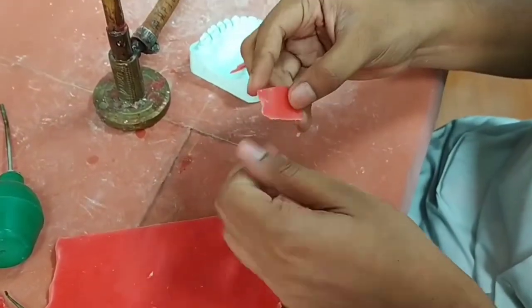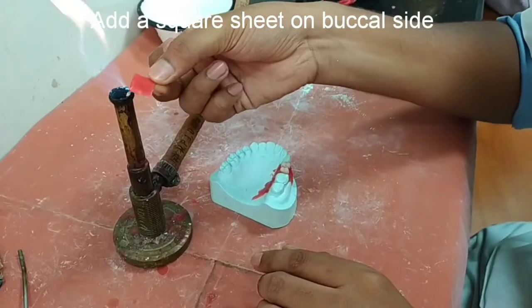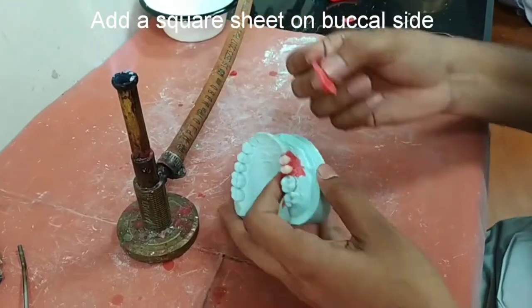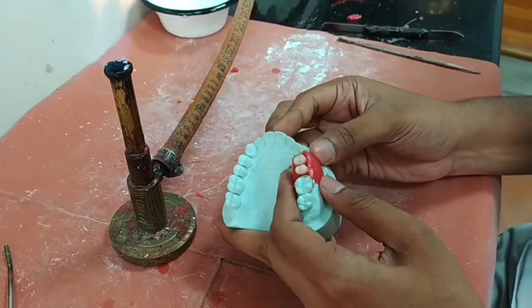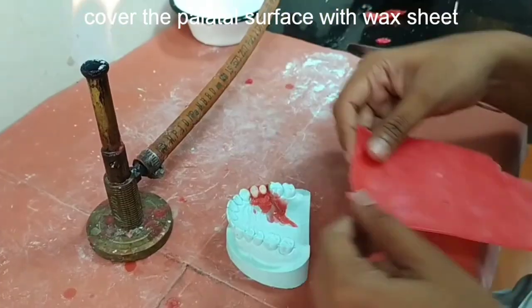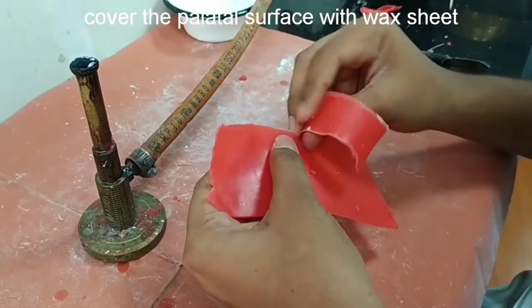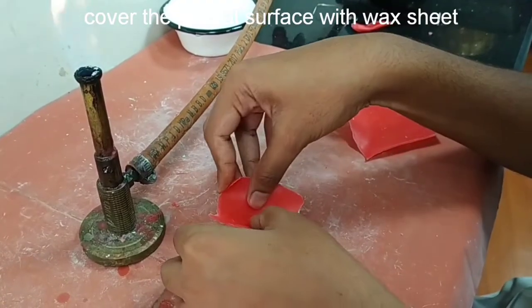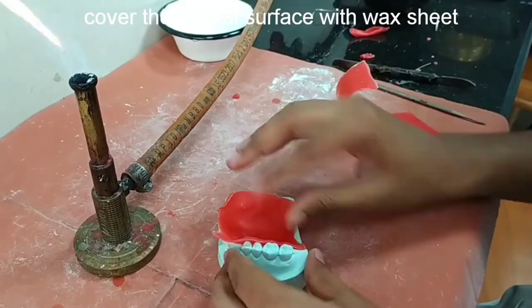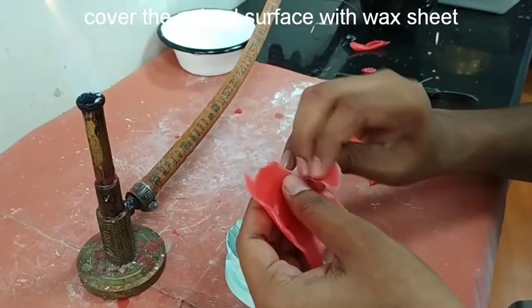After this, add a short strip of wax on the buccal side and also on the palatal side. Cut the proper shape of the wax sheet and fabricate it on the palatal side.